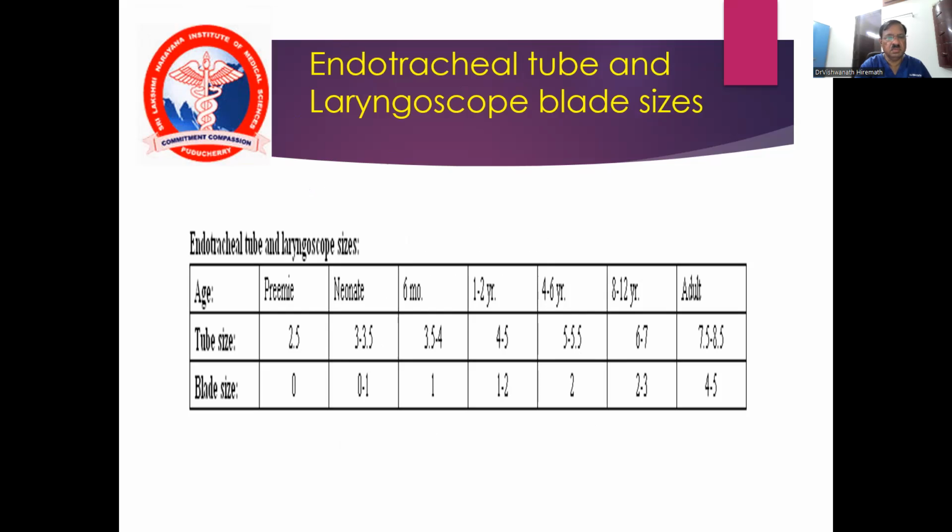There are various sizes of tubes and laryngoscope blades. Invariably, for an average man, an 8 to 8.5 number tube is used. For an average female, 7 to 7.5. However, half size smaller and larger should be kept as a standby.